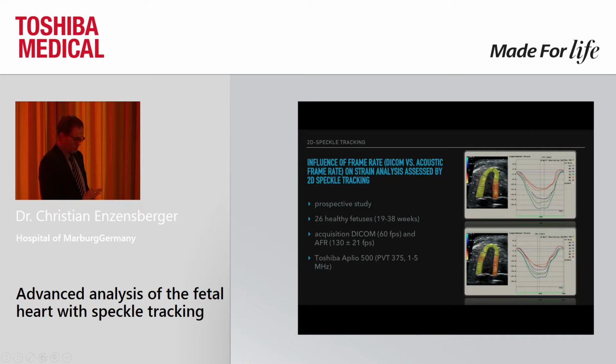Now, this was just DICOM frame rate, 30 and 60 frames, and we wanted to check the influence when you take DICOM and acoustic frame rate. As you can see here, the acquisition rate was, on the one hand, 60 frames of DICOM, and the acoustic frame rate was around 130 frames per second.